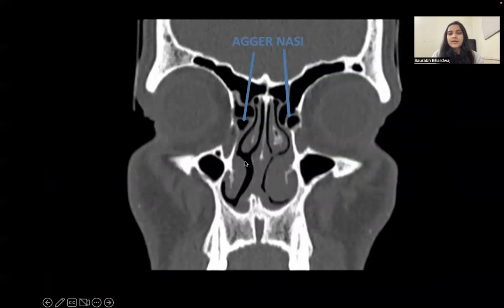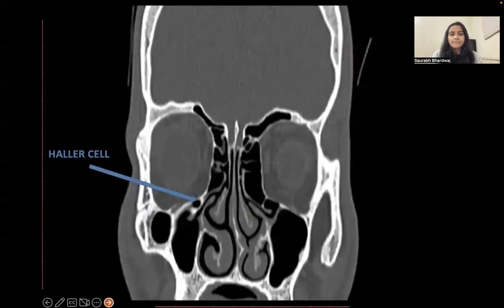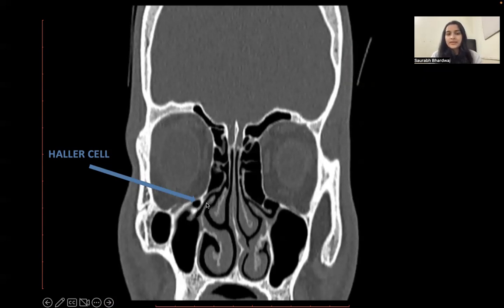This coronal reformat image shows bilateral agger nasi cells, which are the anterior-most ethmoid air cells. In the next coronal reformat image we can see infraorbital ethmoid air cells unilaterally, which are the Haller cells seen on the right side.